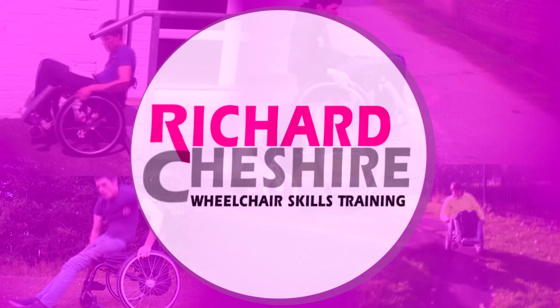So nothing makes you appreciate your chair more than not having it. And in some situations it's not a good idea to take your chair. For example, if the door is not wide enough for your chair and you need to get something inside, or your chair isn't available at the moment and you need to get to your chair.